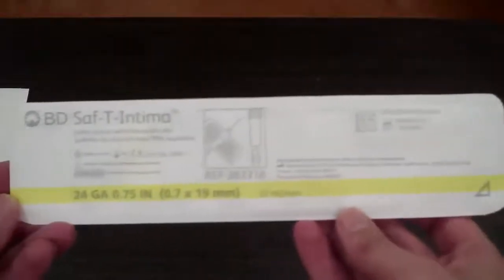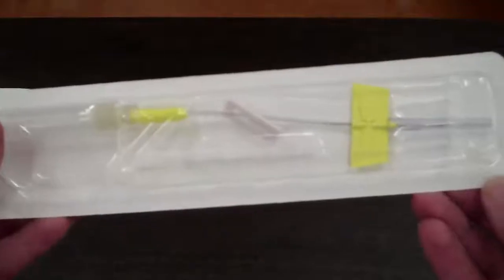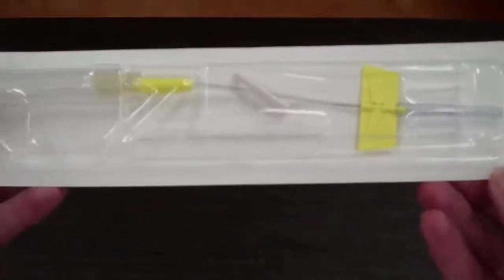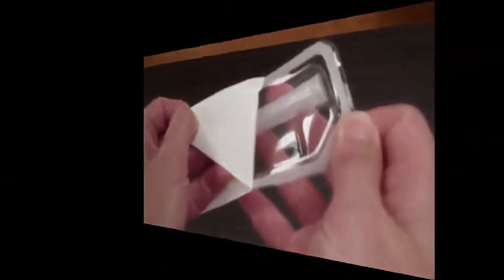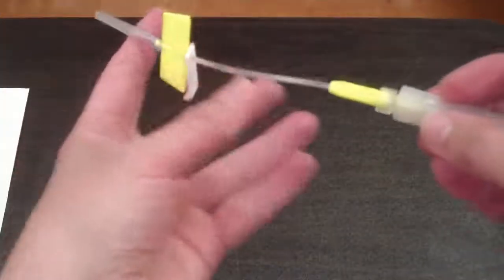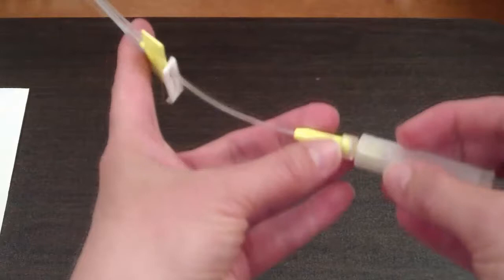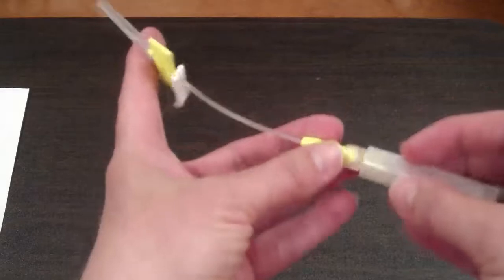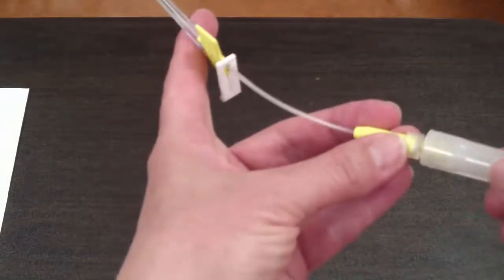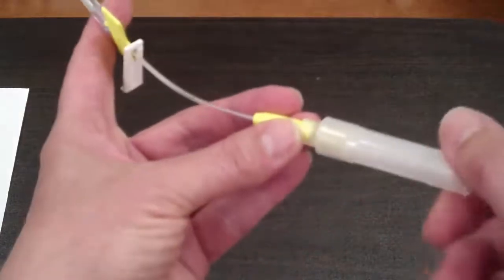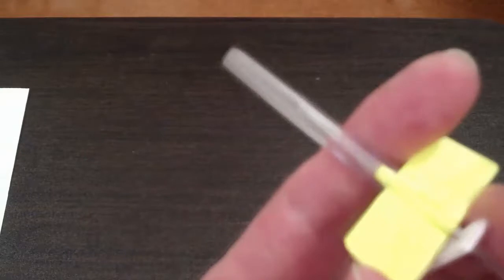This is the Saf-T-Intima subcutaneous butterfly. Remove the butterfly from the package. Rotate the safety barrel to loosen the needle. You do want to ensure that the bevel is up when you insert the butterfly. The pebbled side of the butterfly wings will be going against the client's skin.